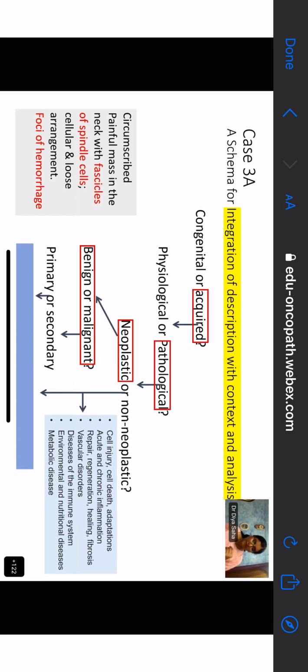So I describe it and you make a diagnosis of a schwannoma. And that is exactly what I keep telling you on and on. A description should be such that somebody who is blind can actually make that diagnosis. You saw what I saw. Isn't that right?